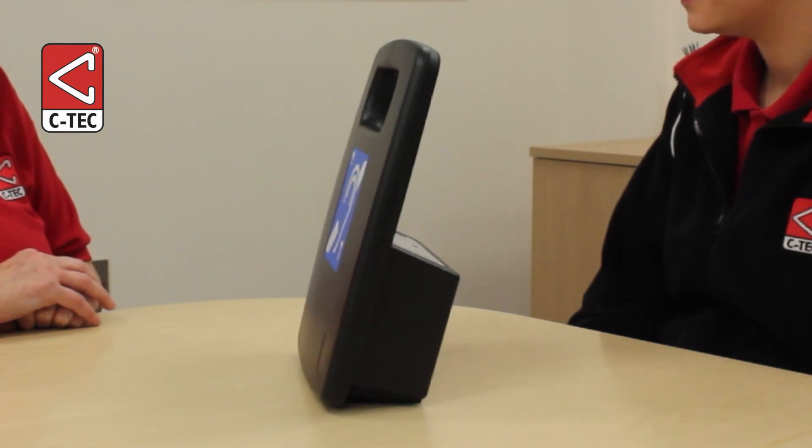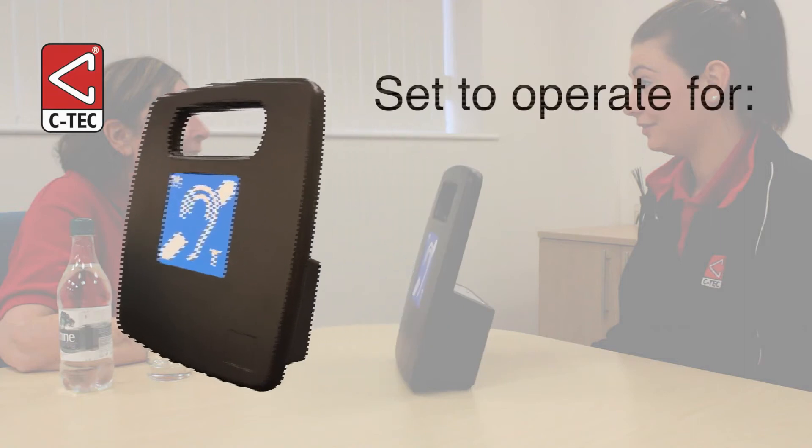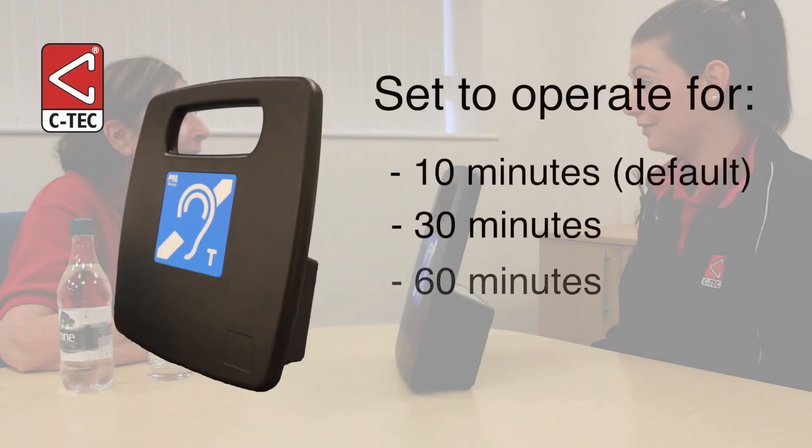The amplifier is set to operate for a default time of 10 minutes to ensure its battery does not run low. If required, you can extend this period so the amplifier operates for a default time of 30 or 60 minutes.